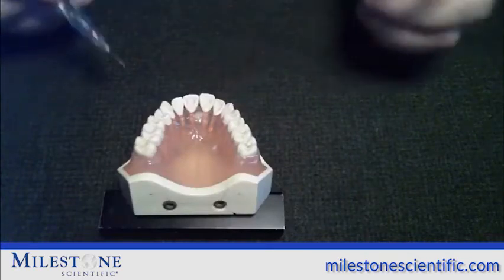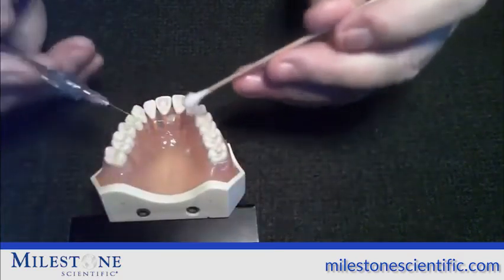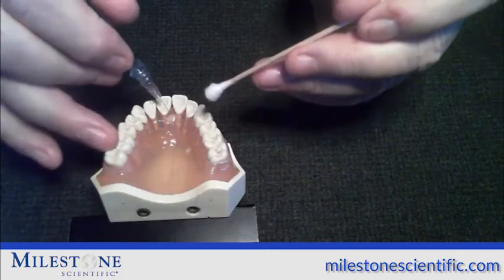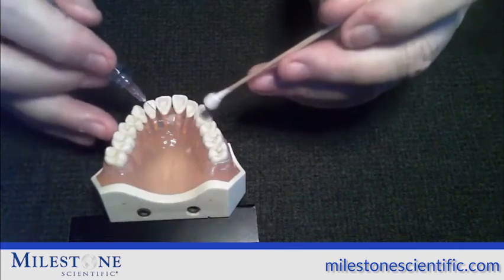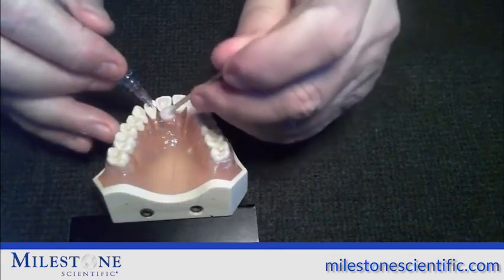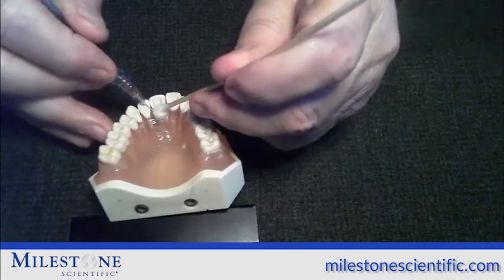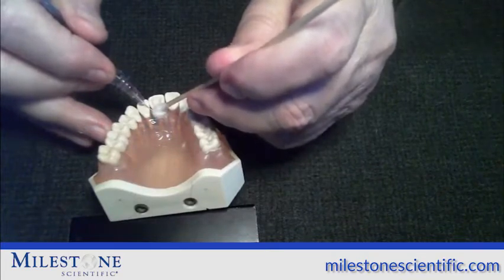The PASA is another injection that's very valuable and will anesthetize six anterior teeth. To begin this injection, we use our pre-puncture technique. We find the bevel of the needle and lay it on the injection site, which is just lateral to the incisive papilla. Do not inject directly into the papilla because that tissue is very dense and may cause difficulty. Instead, there's a little groove just lateral to the papilla — that's our injection site. We use the pre-puncture technique by putting the cotton tip applicator on the back end of the needle and on the tissue, applying a lot of pressure. We then start the flow of anesthetic by hitting the foot pedal until the voice says cruise, then take our foot off the foot pedal — now on cruise control.